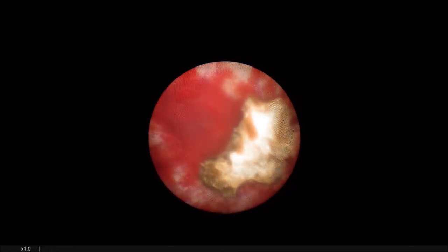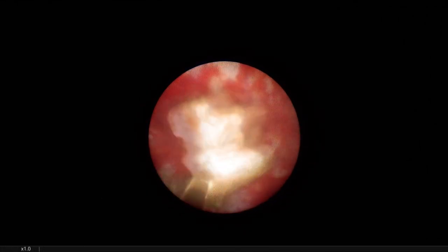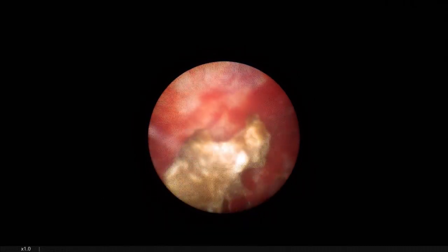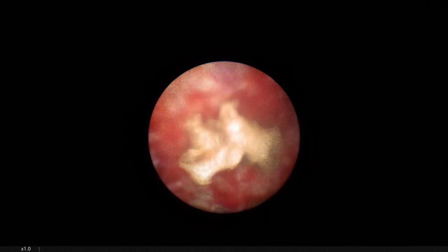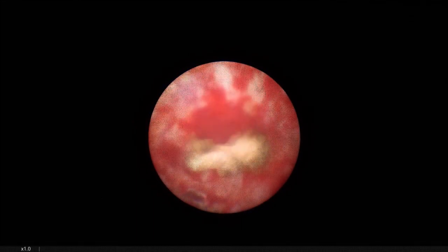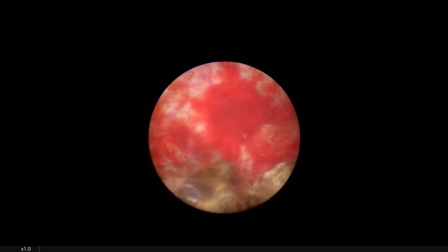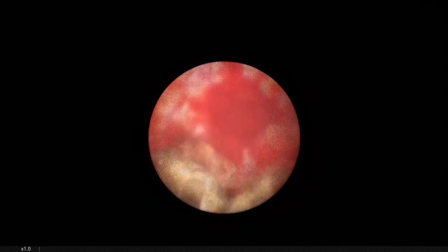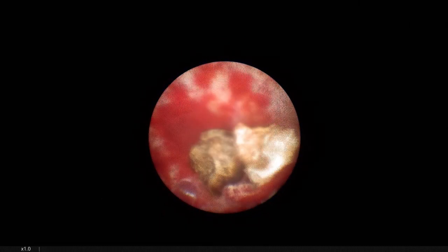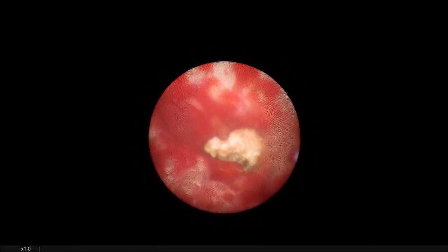Sand is coming out? Like the sand? Yeah, yes, maybe. Bigger fragments need to be removed. Yeah. I think the main difficulty is to have patience. Yes, yes, of course. But we have both stones. I think yes, we already met both stones. Yes, we need a lot of patience.